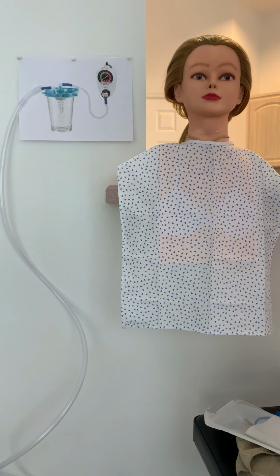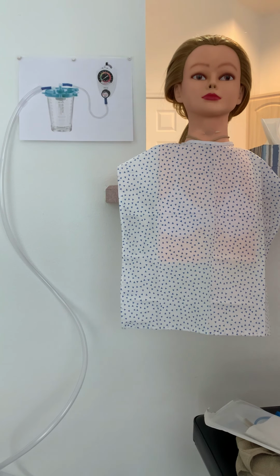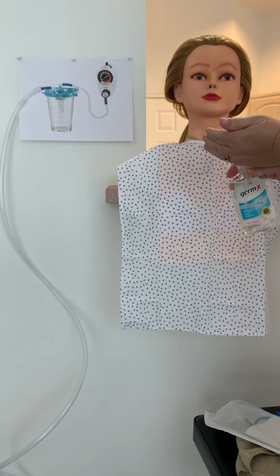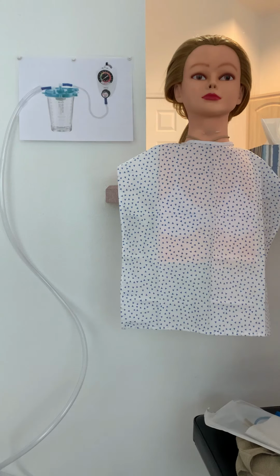All right. I'm going to make sure she has some facial tissues within reach. And I've got a towel that I'll put over her chest, and I will do that after I measure the tubing. So if we're ready to begin, then we'll go ahead and wash our hands again. And we will put on some gloves.